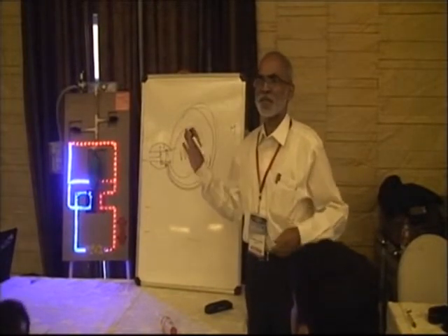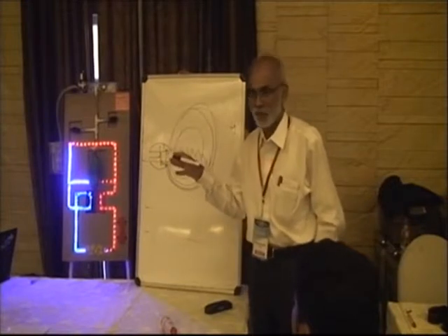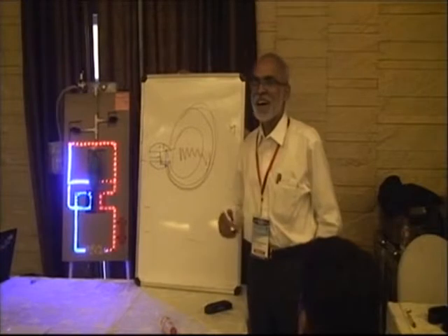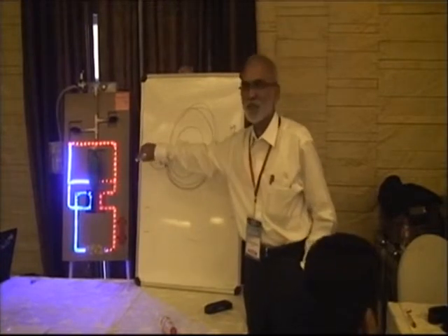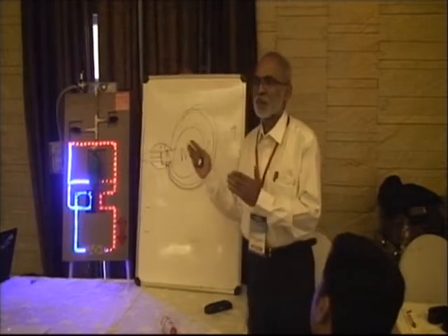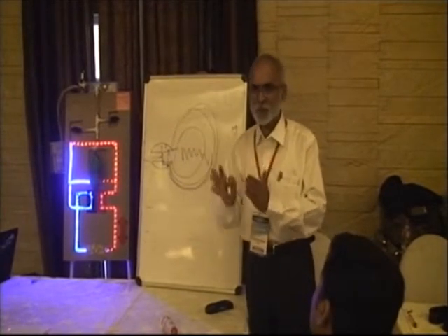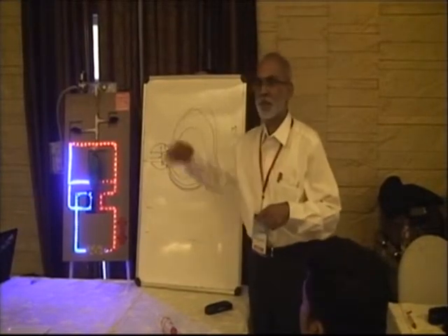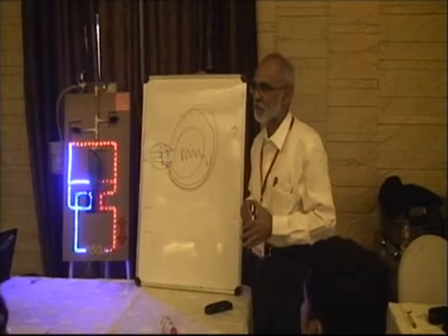But the important thing is the cost. This was made for 20,000 rupees. That would be costing 6 crores. And it has these comprehensive components, so you get a feeling that you have the ventilation perfusion relationship, which is a very important part of achieving proper oxygenation.